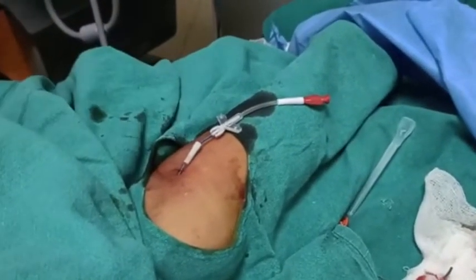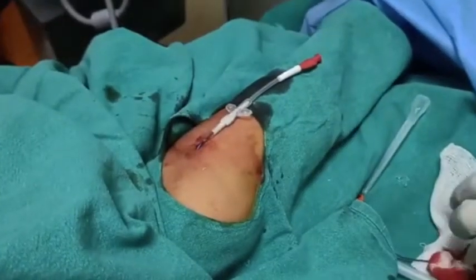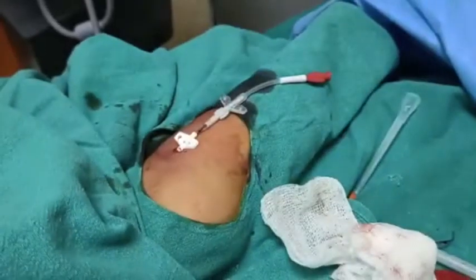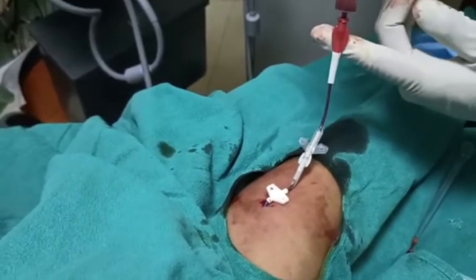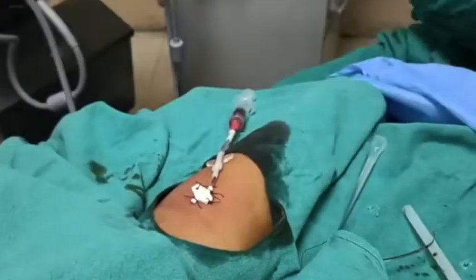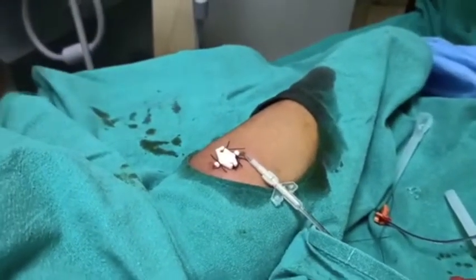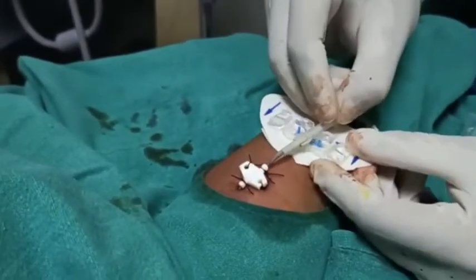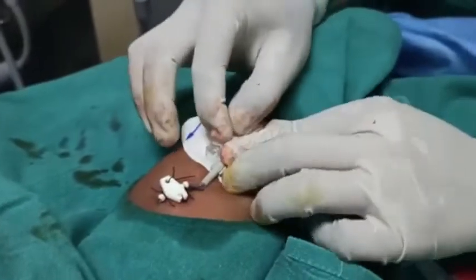Then we have to put the connector. We fix the PICC catheter with sutures. We have flushed it with a heplock. This is a stat-lock which is available for securing the PICC catheter.